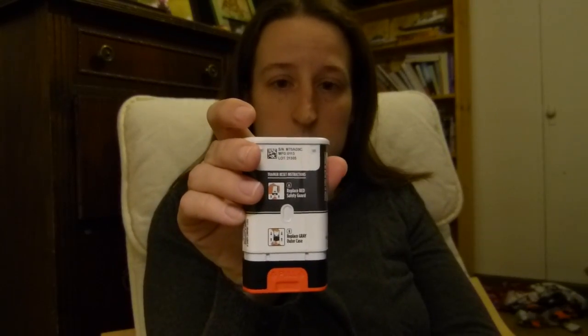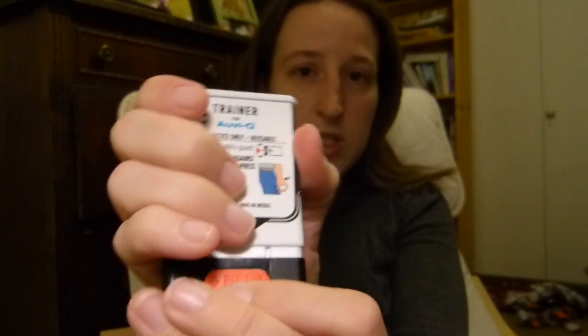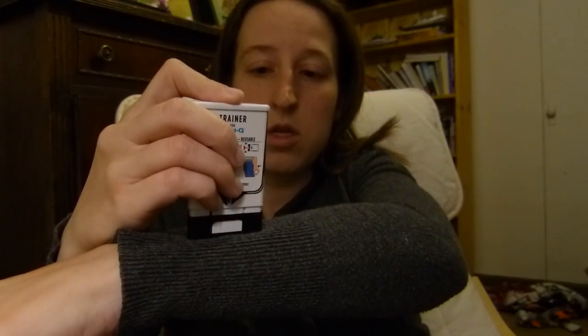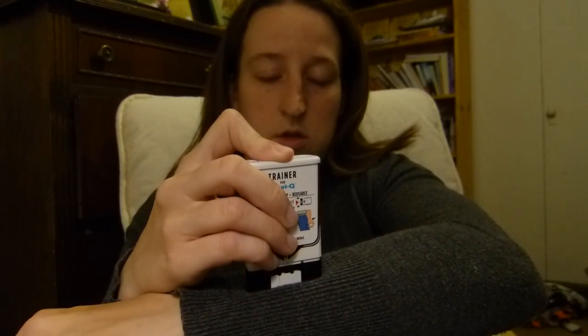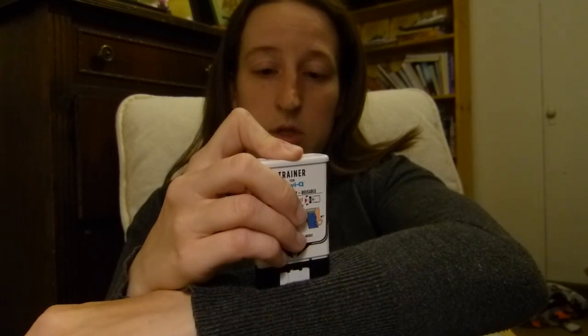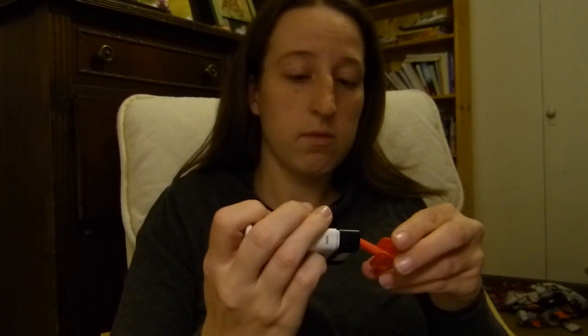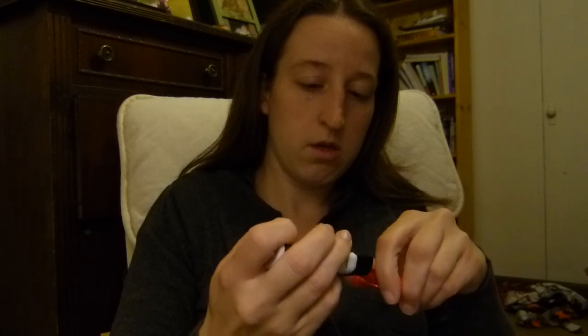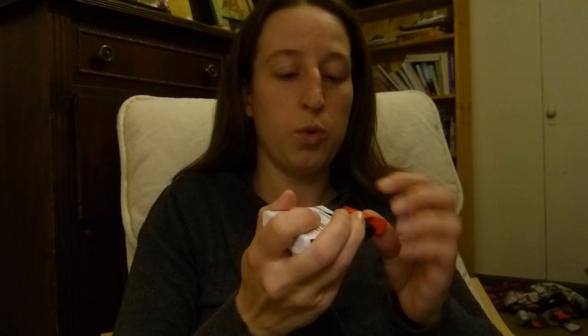This trainer contains no needle or drug. If you are ready to use, pull off red safety guard. Where it says pull. If to inject, place black end against outer thigh, then press firmly and hold in place for 5 seconds. 5, 4, 3, 2, 1. Injection complete. This trainer may be reused for training purposes. Replace the red safety guard and gray outer case.